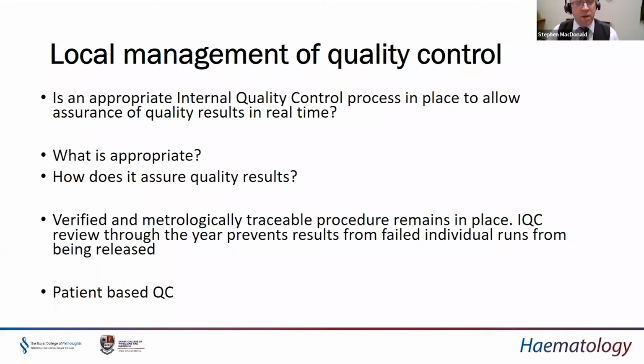And what's coming more and more prevalent with that is the metrological calibration to the higher standard and the requirements of your suppliers to produce that traceability information. So don't worry that we have to produce the data for this metrological traceability. That should be provided by your suppliers and your manufacturers.